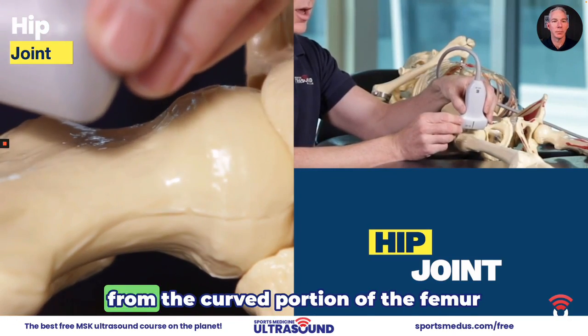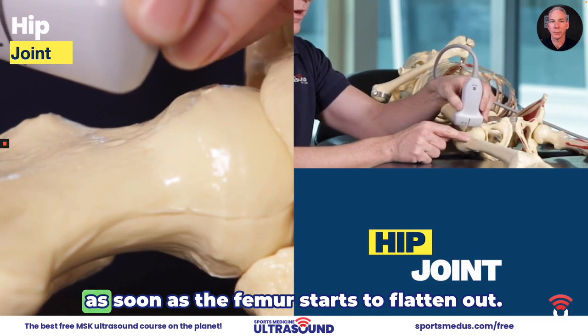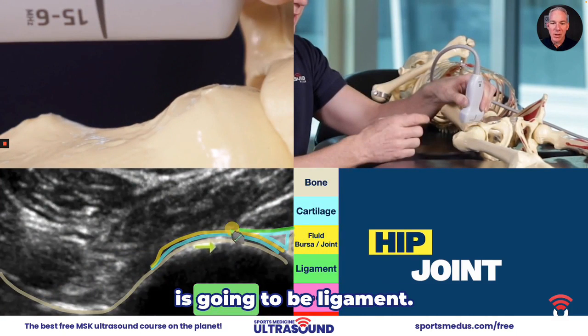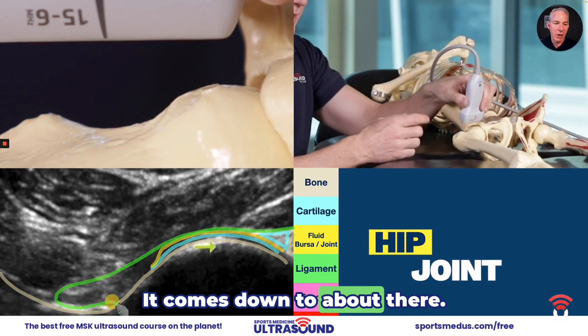We're going to slide the probe away from the curved portion of the femur. As soon as the femur starts to flatten out — ligament. What connects bone to bone is going to be ligament. It comes down to about there.